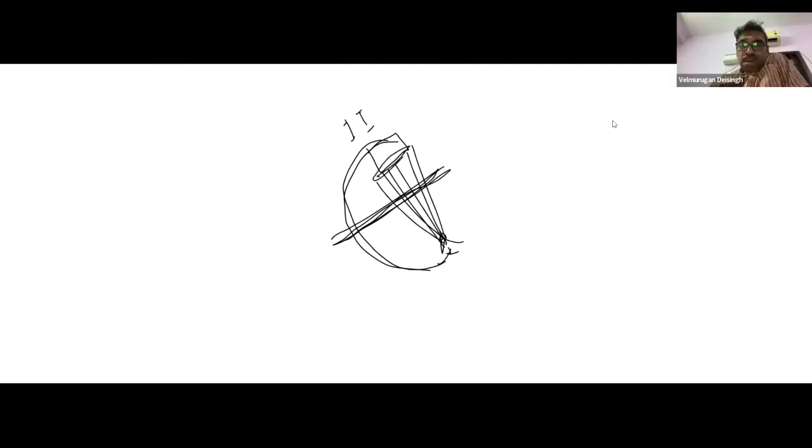When you're doing the C-arm, the patient is normally in the prone position. This is your back, here is your spine, this is your abdomen. So this view is called the AP view. Why? Because the C-arm beam is coming from the anterior to the posterior.